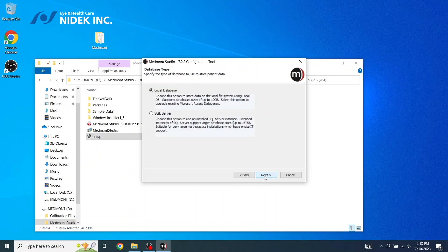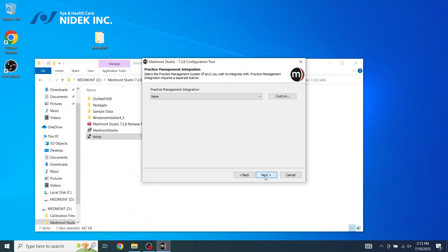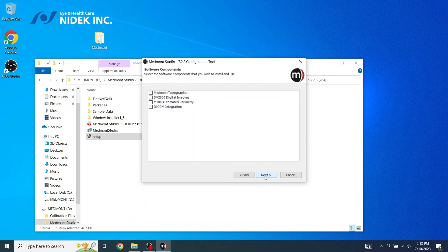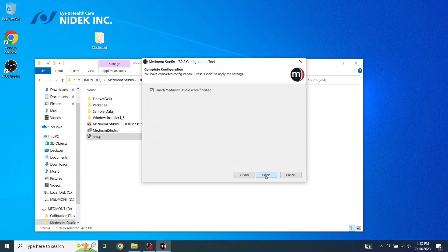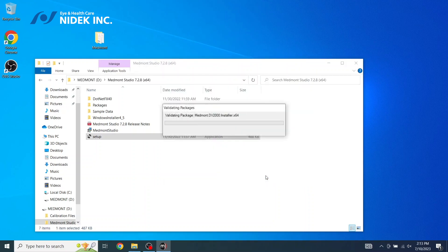Next. Next. Next. Next. And Next. Here, we're going to select Medmont Photographer. If you're utilizing any other Medmont devices, you can select that modality. Select Next. And then Finish.